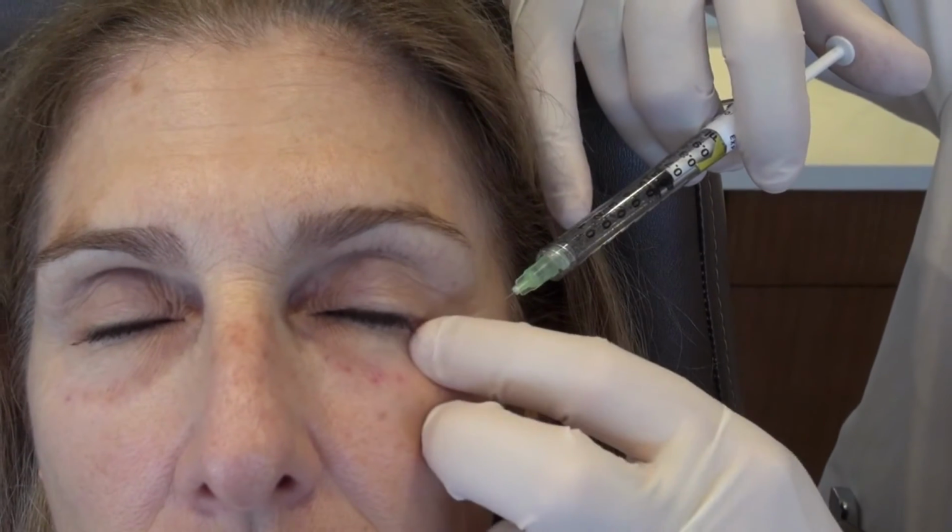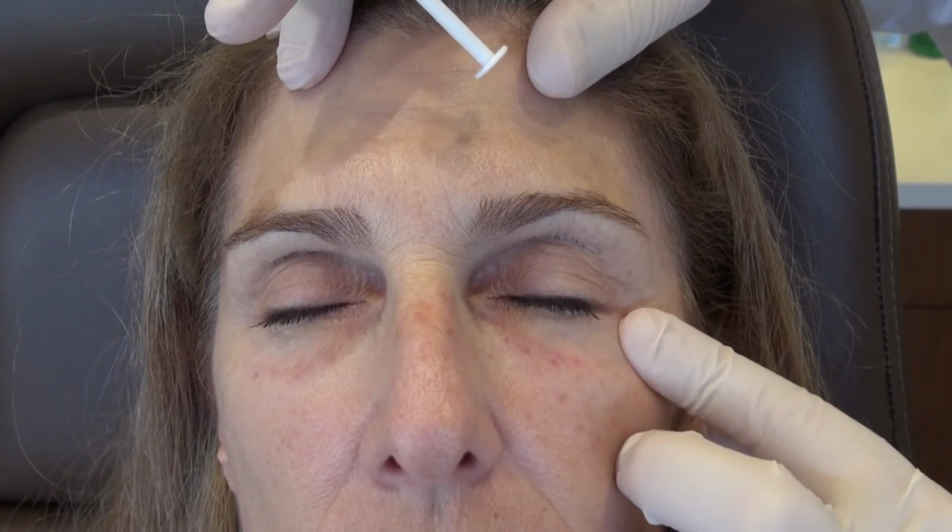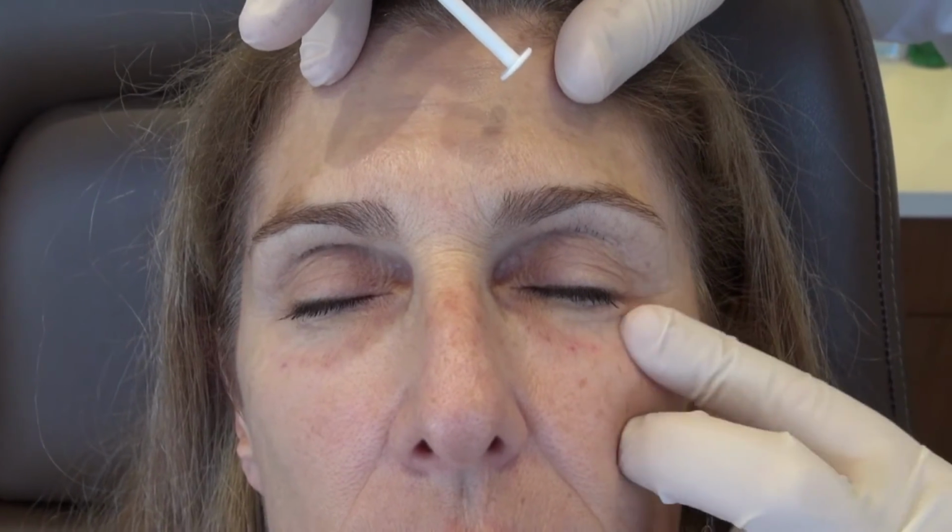Okay, open your eyes. Come back. And a critical aspect of the consultation process is to make the patient understand that this is a procedure for the tear trough hollow, not for the fine lines under the eyes. And those fine lines, they'll improve a little bit as we fill the hollow and as we plump up the skin. But they'll still have those fine lines afterwards. Come forward. They just won't, in my opinion, matter as much.